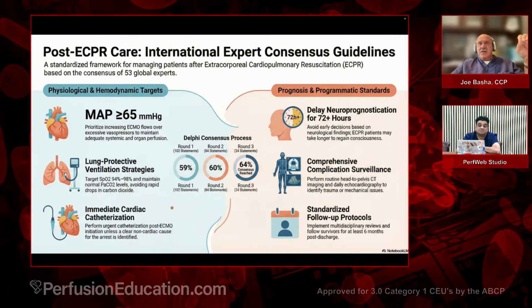if you take a patient who is acutely hypercarbic from an arrest and/or a CPR event, and you put them on ECMO and you drop their PCO2 too rapidly, it is suggestive of increased risk of cerebral hemorrhage. And so that's something I've just recently learned in the past few years. So be very careful of that.